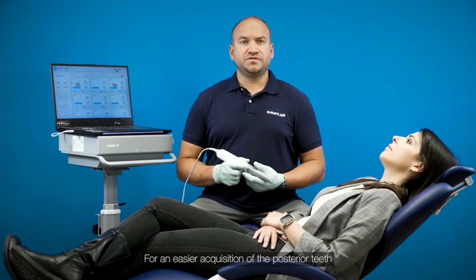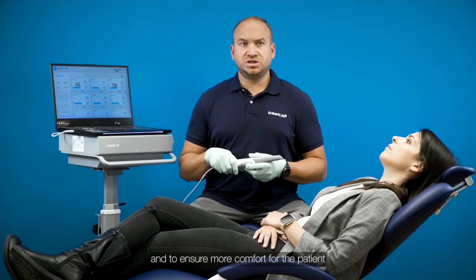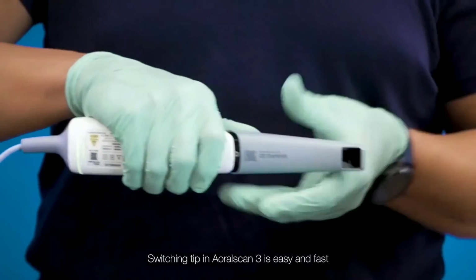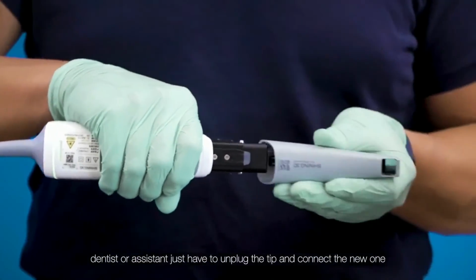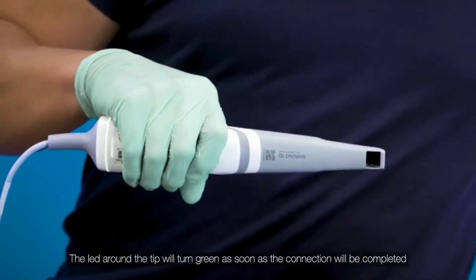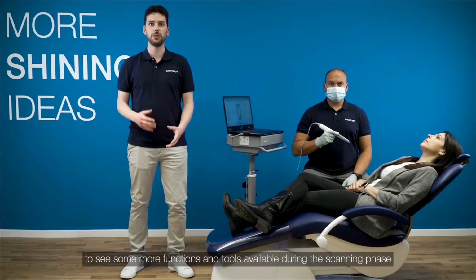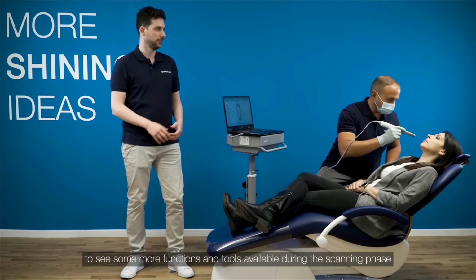For an easier acquisition of the posterior teeth and to ensure more comfort for the patient, we can now switch to the smaller scanning tip. Switching the tip in AORALSCAN 3 is easy and fast. The dentist or assistant just has to unplug the tip and connect the new one. The LED around the tip will turn green as soon as the connection is completed. Let's move on to the next step, to see some more functions and tools available during the scanning phase.